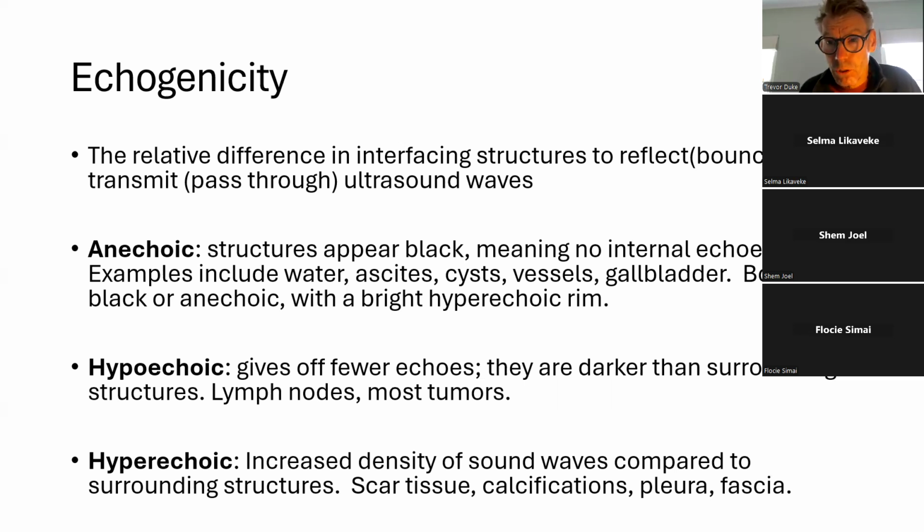Our bodies are made up of different structures with different echogenicity. They will handle sound waves in different ways. I'll try to explain some of those things.